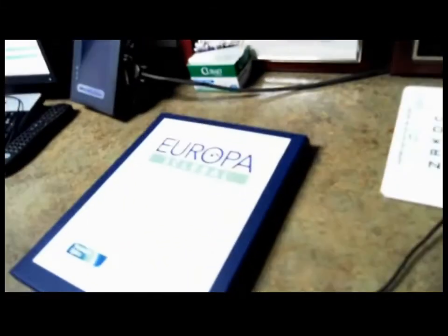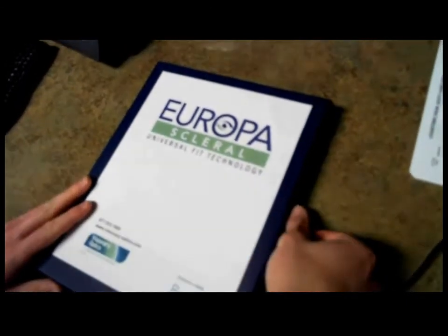We're now going to select some lenses to put on Darlene. And when you're selecting lenses, first of all, you always need to fit Europa sclerals diagnostically. So you need to have a diagnostic fitting set in order to do this properly. And so here we have our diagnostic fitting set.